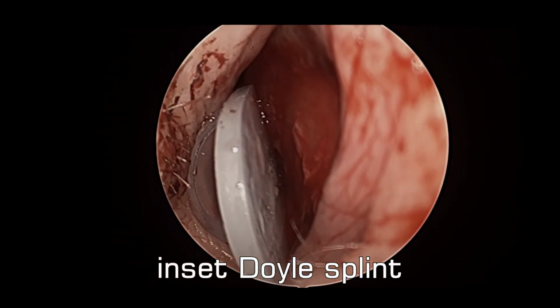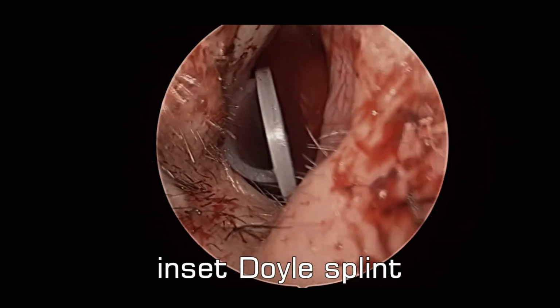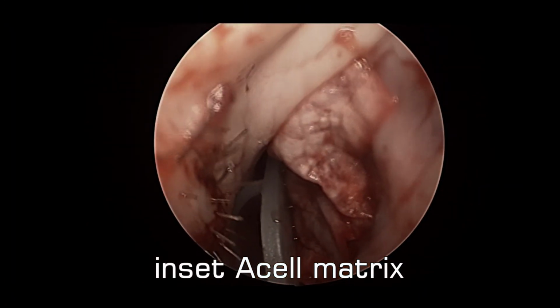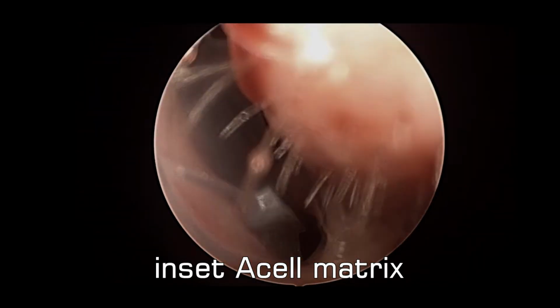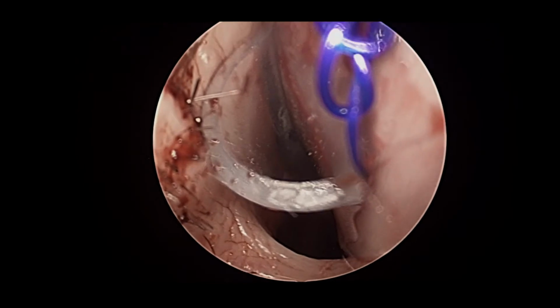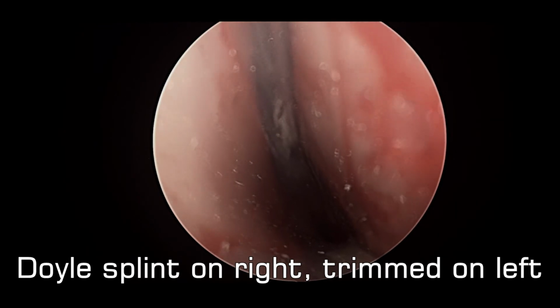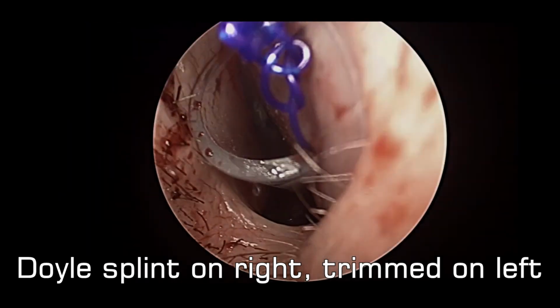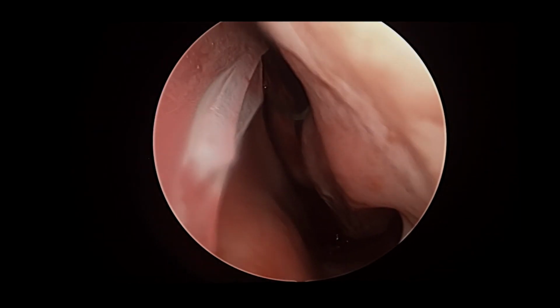A Doyle splint is inserted into the right nasal cavity prior to placing an Acell graft into this area between the denuded region of septum and the Doyle splint. This material is rich in growth factors and will allow the mucosa to heal from the edges to cover the area. And we see the Doyle splint sutured in position now that is fully overlapping the Acell material, which is lining this denuded area, with a small button on the opposite side to anchor the suture.